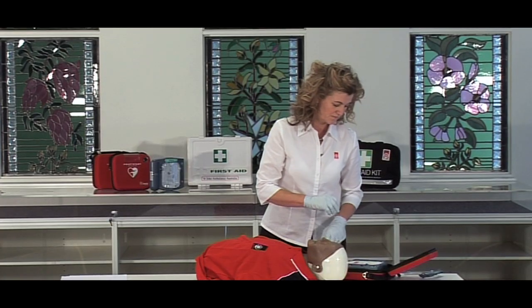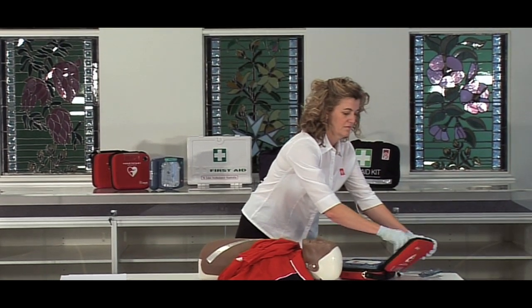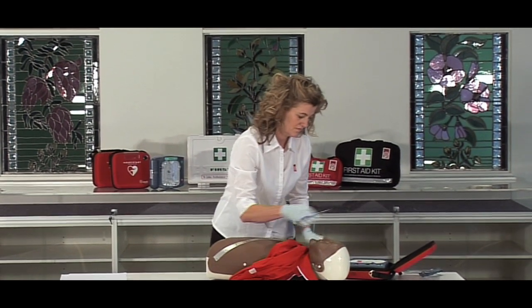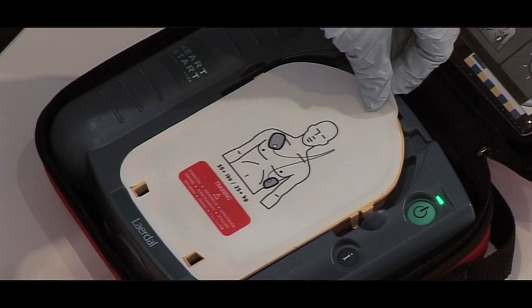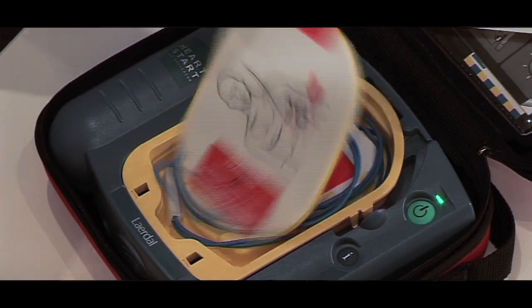Begin by removing all clothing from the patient's chest. Cut clothing if needed. When the patient's chest is bare, remove the protective cover and take out the white adhesive pads.